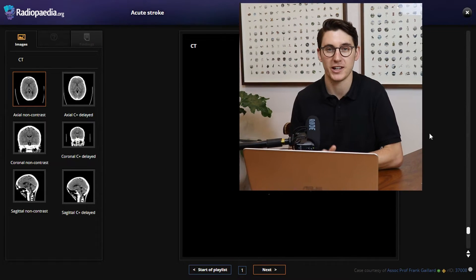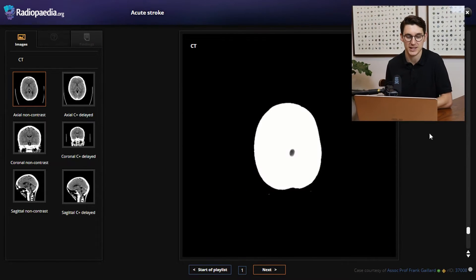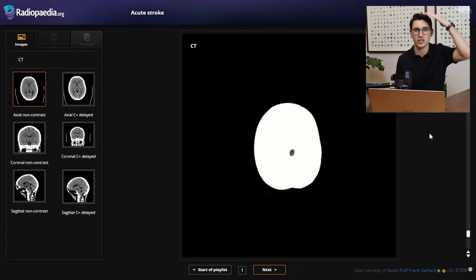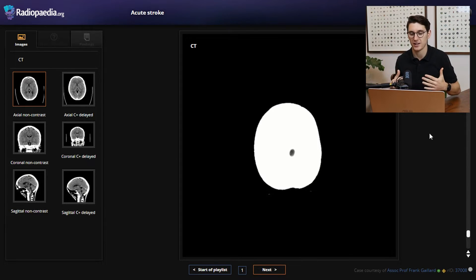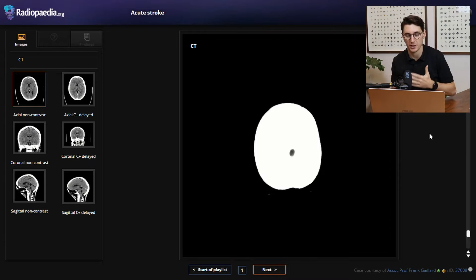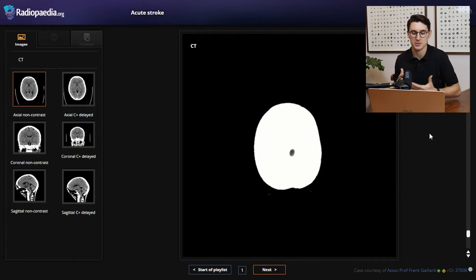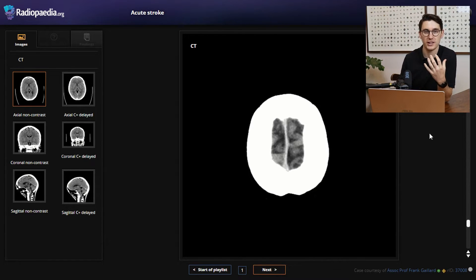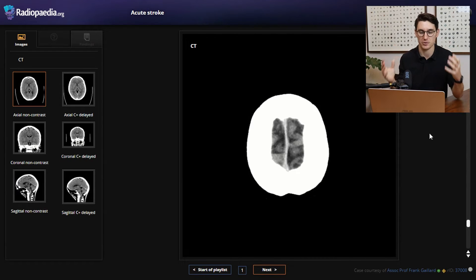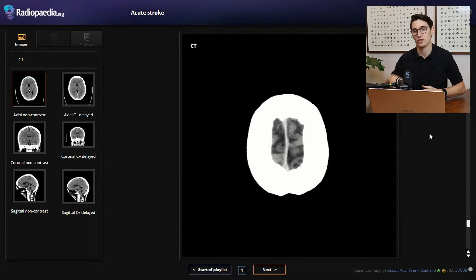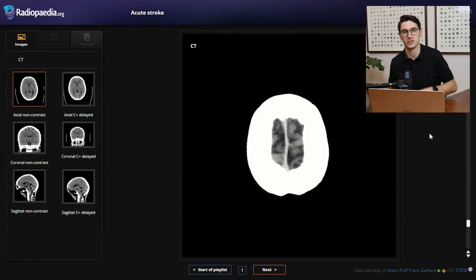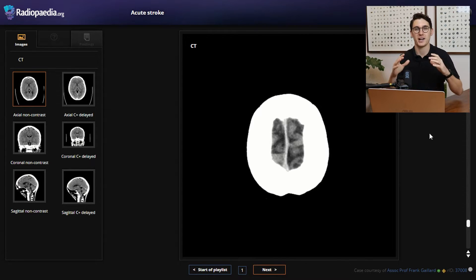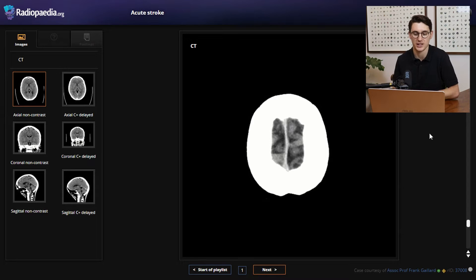Let's start by looking at a normal CT scan — an uncontrasted CT brain. I like to start at the vertex and scroll my way down; some people start at the bottom and scroll up. Find a system that's most comfortable for you. What we want to do is scroll down slowly and look for any gross abnormalities: look for midline shift, look for a large bleed, look for a mass. Once we've scrolled through, we can scroll back up and start looking for specific signs.